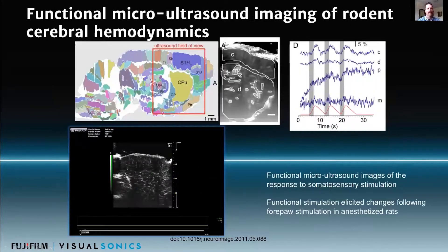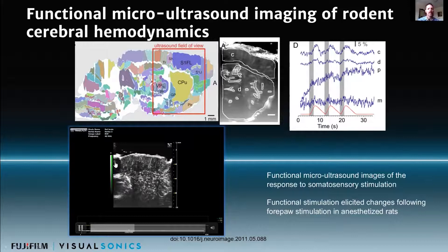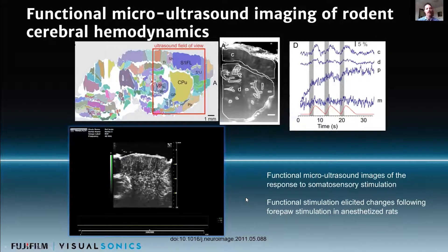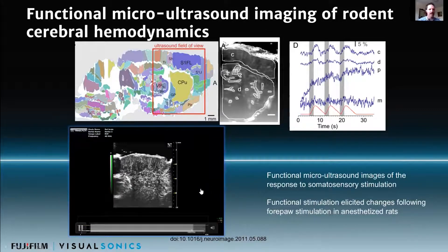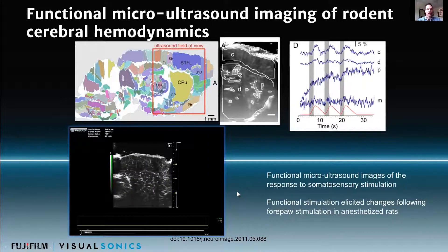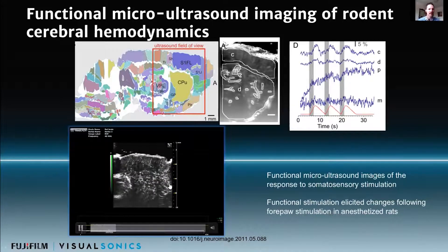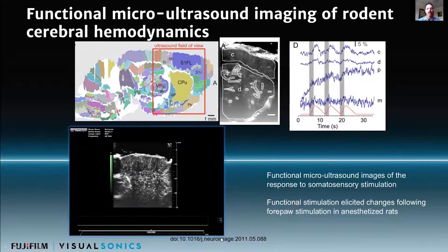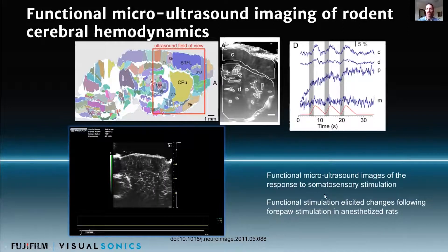This is a way of enhancing contrast. This beautiful image shows bubbles tracking through the circulatory system in the brain of a rat where there's been a craniotomy, giving really nice high resolution images because there's no skull to interfere with the ultrasound. In a 2011 neuroimaging paper, they were able to do functional imaging using ultrasound, looking at different somatosensory stimulation and how that influenced changes in vascular flow in the brain.